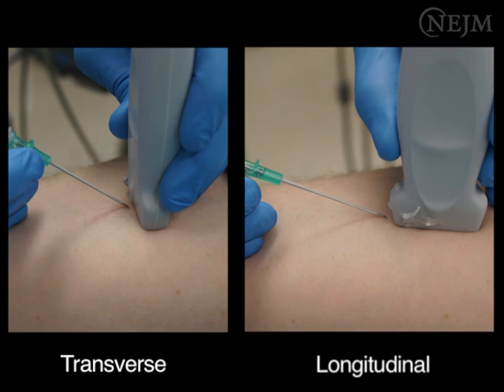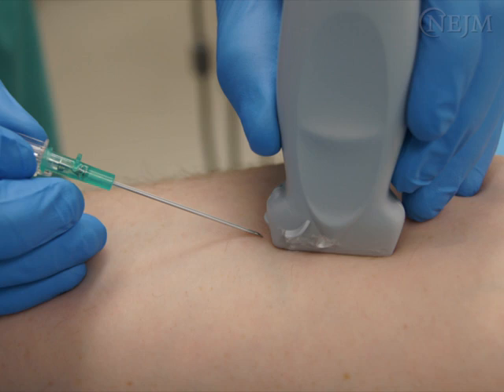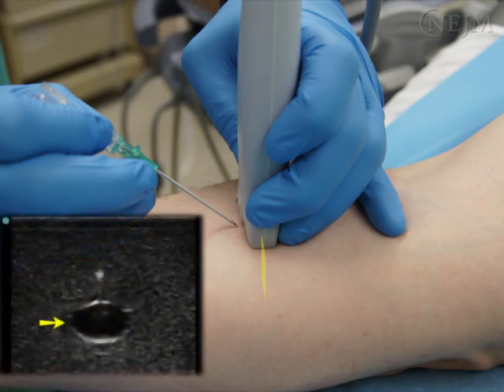There are two commonly used techniques for ultrasound-guided vascular access, the transverse technique and the longitudinal or in-plane technique. Transverse or longitudinal describes the orientation of the ultrasound plane with respect to the vein and the needle. In the transverse technique, the ultrasound plane is transverse to the vein and the needle, so the vein is circular and the needle is a single bright dot.